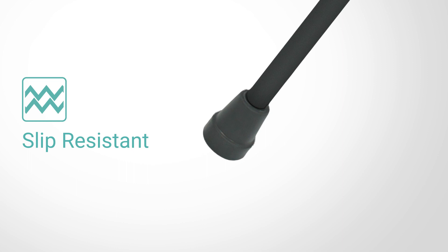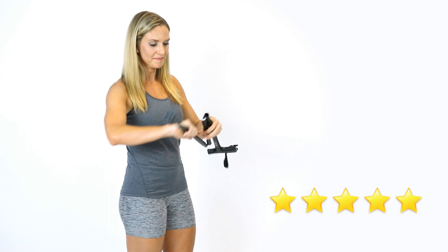The folding cane by VIVE is trusted and proven. There are hundreds of five-star reviews. Plus, it's backed by an unconditional lifetime guarantee. You can't beat that anywhere, so confidently order your cane now for portable mobility.